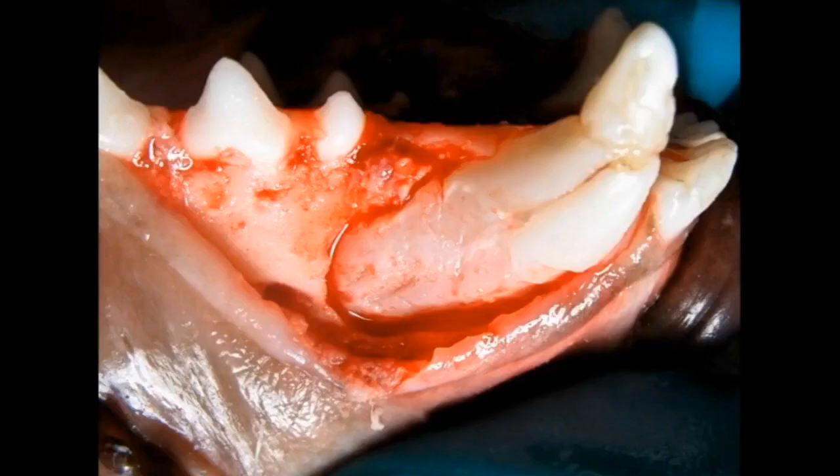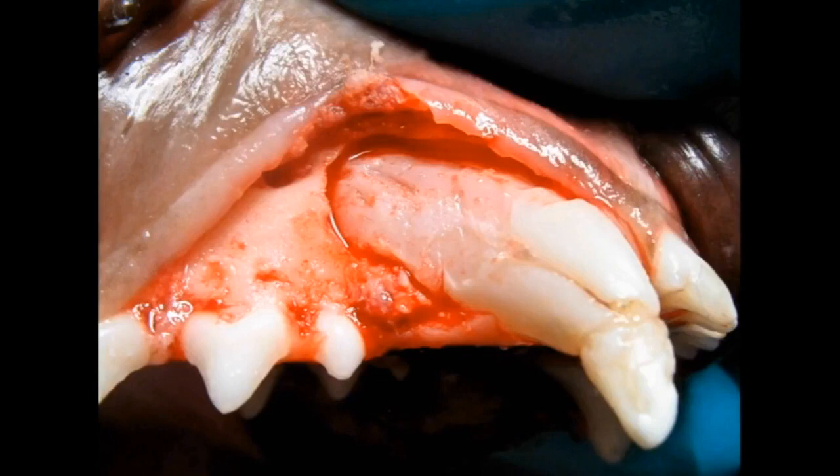Here is an image of another tooth showing the exposure we get during a surgical extraction. We go down to the mental foramen peeking out from underneath the gingiva where we've removed the vestibular bone. We've made our grooves around that tooth and are ready to place the luxator. If we come from the top going obliquely backward, that's wrong — we want the patient positioned so we go from us to the patient directly.